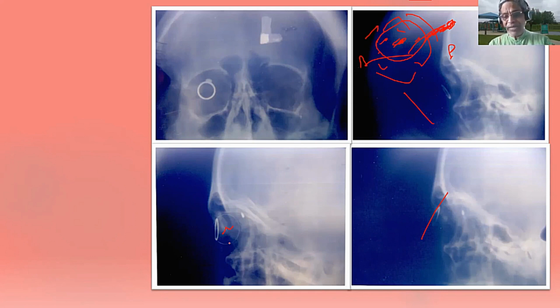Now the foreign body is outside. I know the foreign body is outside, but some drawback is there, because of the difference in length of the eyeballs in different patients. Now I'll ask him to look down and look up. Sir, if I see movement of the foreign body, it is inside the eyeball. If not, it is outside. Inside itself, if it is in front of the center of rotation, it moves with the eyeball movement.